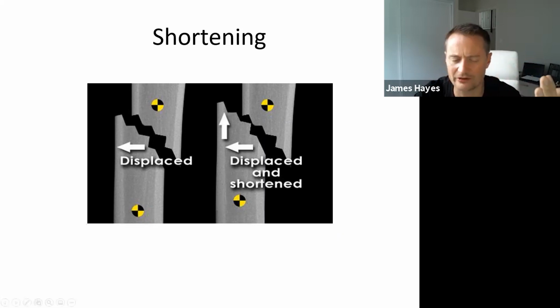So if you think about a total hip replacement, it shows up as a bright white thing in the hip, all right, in the shape of a total hip replacement. And if you think about air in the lungs, it shows up as black. So if there's a gap, it'll be black, and if there's white, it's extra stuff. So if this is compacted, that's because there's extra bone in the way. So there could be twice as much bone in the way of the radiation just for that little line. So look for white lines as well as black lines.